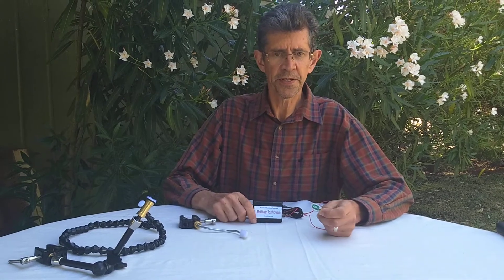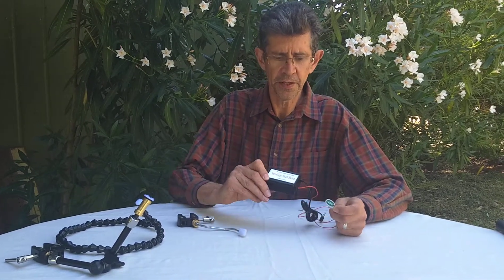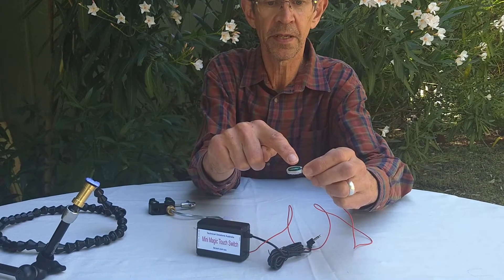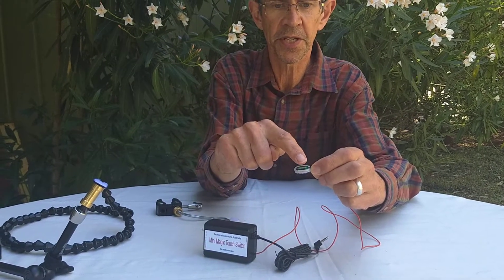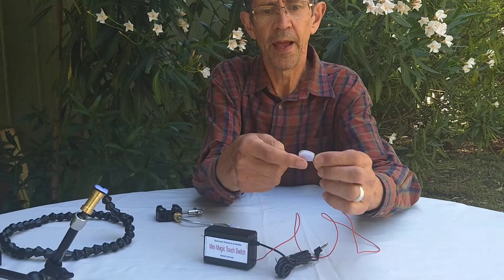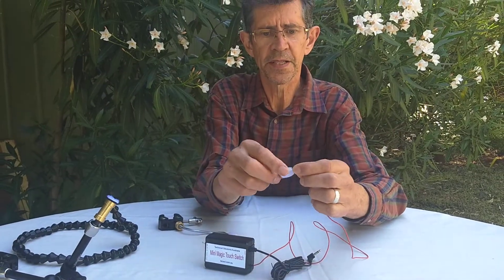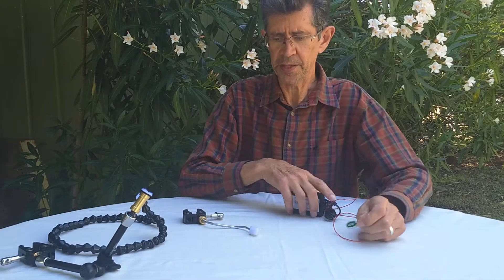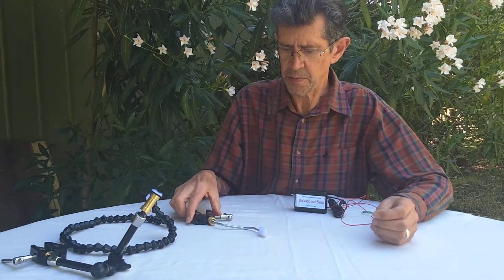It's Ian from Technical Solutions and we've just invented this new switch, the magic touch switch. It has this lead with this tiny probe on the end that you can just touch on and that activates the switch. It has velcro on the back of that little sensor and we've got a range of different mounts.